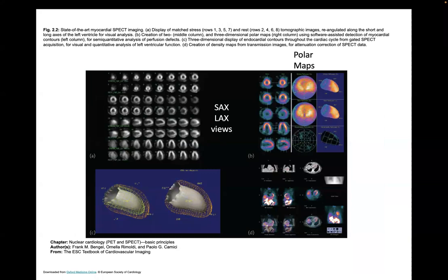And we'll get right to the heart, or what is created by this scanner, right off the bat here. This is a very busy slide, but we'll just walk through it carefully. These little donut shapes here are slices of the heart, and these are the left ventricle. So here's the left ventricle. This is a 3D model of the left ventricle.